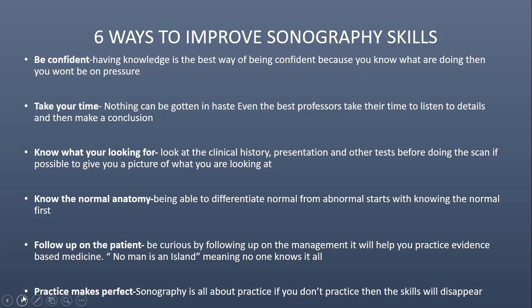Then another thing, you need to know what you're looking for. That's why I highlight that you need to have the clinical history, the presentation. Don't just come because they have called you for a scan, and straight away you're finished. My friend, you need to know what you're looking for. Now that you've been given enough clinical history, you've noticed the patient has a positive Prehn sign, then you know maybe I'm looking at epididymitis. But if you find scrotal microcalcifications there again, don't be surprised, because pathology doesn't read books. These things are all possible.